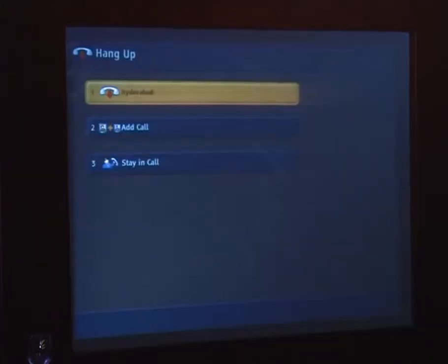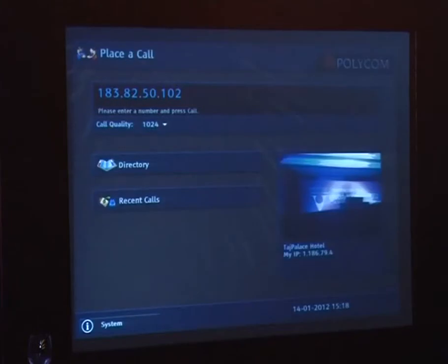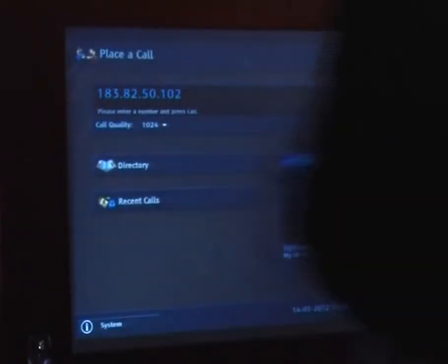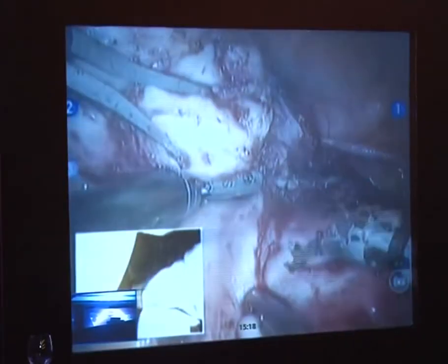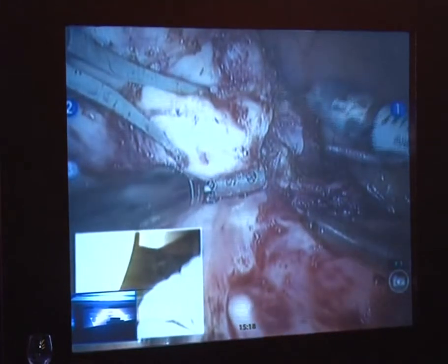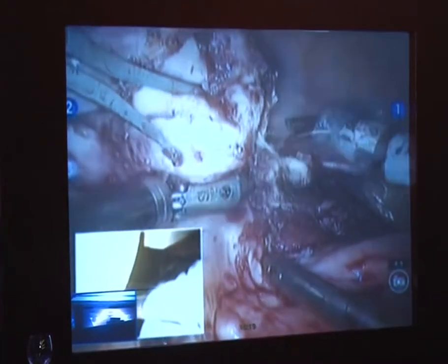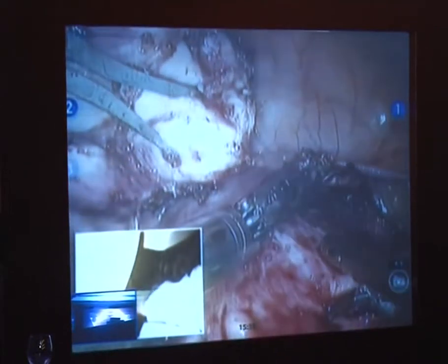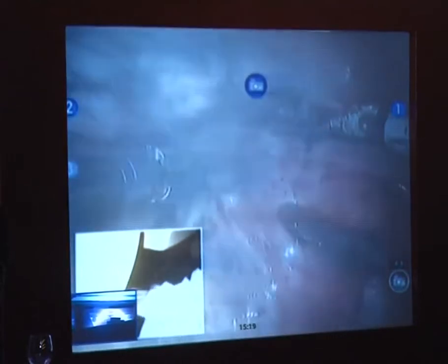Tuck that bad boy back there. Then we'll make an assessment now if there's any major bleeding anywhere that needs to be treated. Can you suction in here? Question from the floor, whether you would change to an angled scope at this point. Not really, because I can see what I need to see in here. I'm going to suction some more in here. Suction more gently. Good. Here, let go.